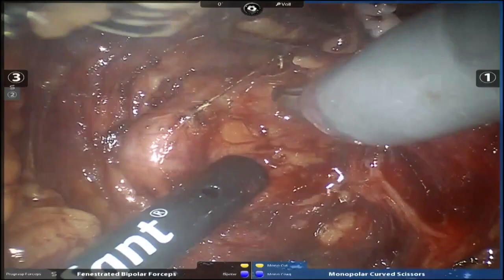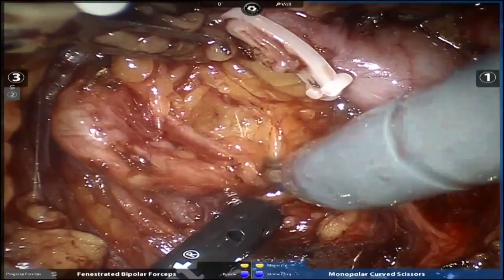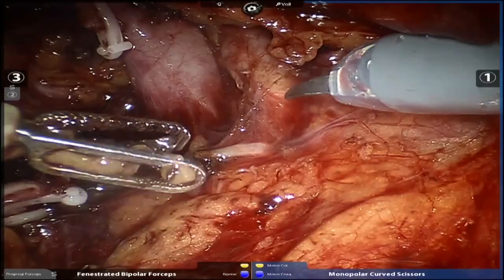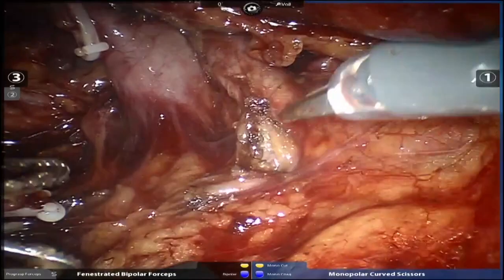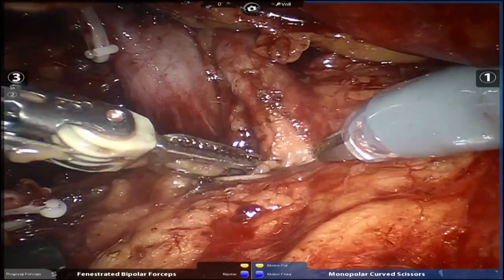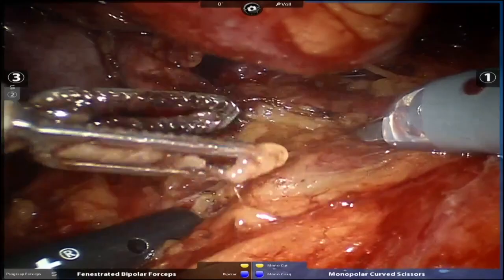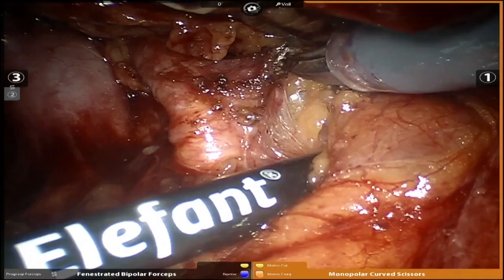All right. Doesn't look like it's going into the aorta, though. It looks like it's starting to curl away. Yeah, if this is aorta here, which we would expect it to be, what's that, Indy? Yeah, exactly. So I've got Dr. Gillen here, which I'm very grateful. He's looking at this anatomy with me. And we are going to make sure we've got everything, just like he taught me how to do many years ago. We take no risks. We make no risks. The case is only going to be successful if we know exactly where we are.